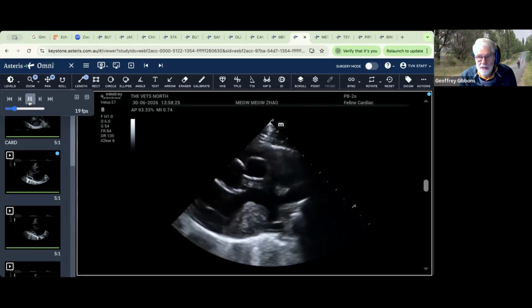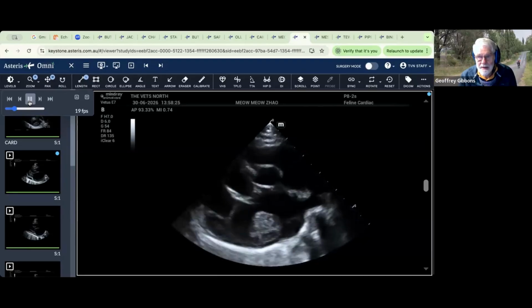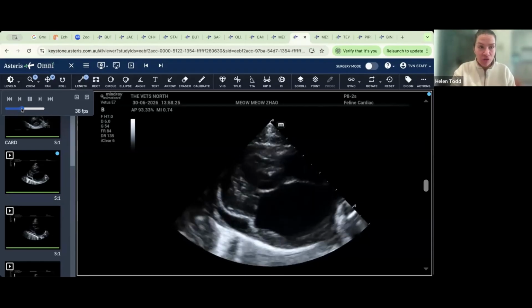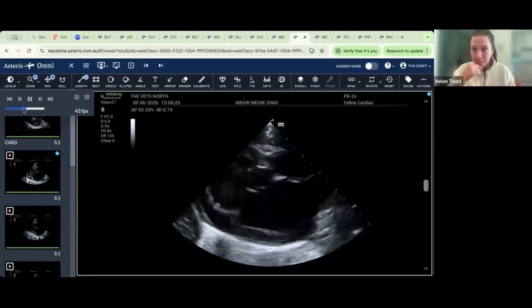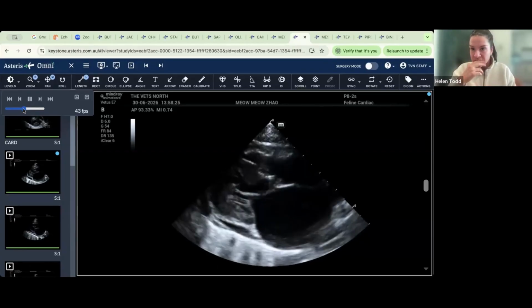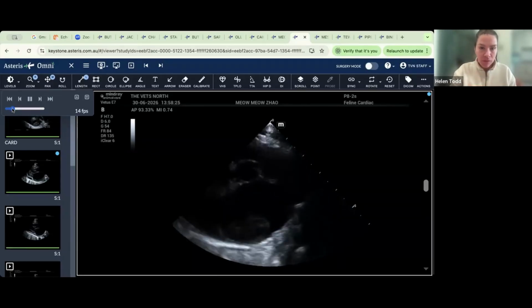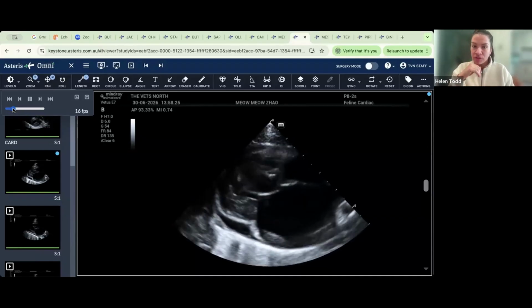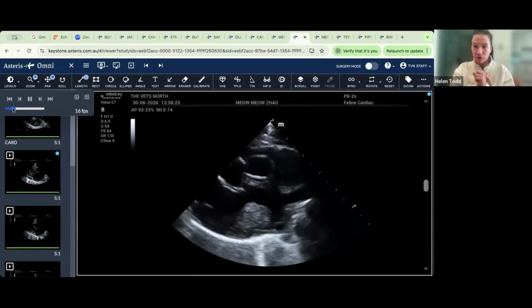Helen, the first cat had a slower heart rate, and that usually is indicative of a respiratory rather than cardiac problem, whereas this one's a bit faster. That's an excellent point. And I've actually slowed this down a lot, so this would be this cat's heart rate in real time. So it's pretty tachycardic. Yeah, that's a great point, Jeff, actually using heart rate. I've slowed it back down now. So subjectively, that's something we should add to the list actually. We can get heart rate in this subjective view as well.